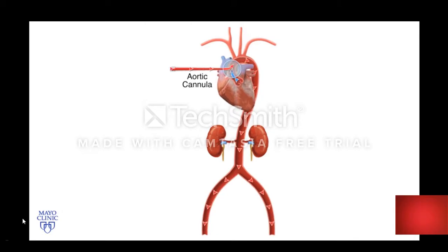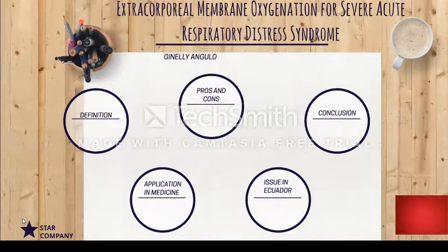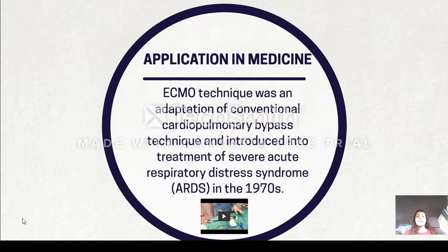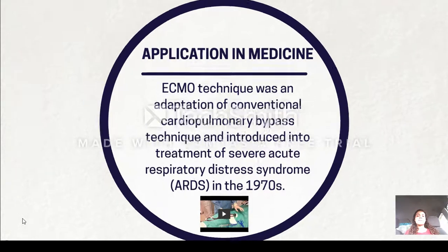Application of ECMO was an adaptation of the conventional cardiopulmonary bypass technique, introduced in the treatment of severe acute respiratory distress syndrome, ARDS, in the 1970s.